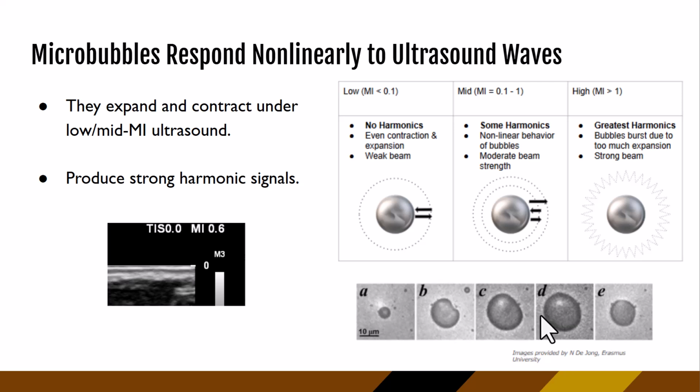And then on the bottom here, we just have an example of a bubble going through different phases. As a sound wave goes through it, you can see it is very contracted, and then it can expand, expands a little bit more, contracts again. So as that sound wave comes through, it'll behave very differently as each part of that wave travels through it.